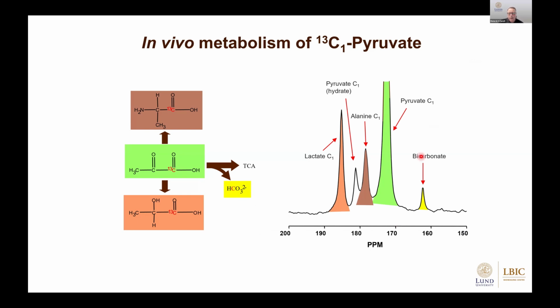We inject the green contrast agent, and during the time, signals for these other metabolites can or might be formed. And that's also the difference between PET and carbon-13. Because for PET, we will not be able to discriminate these three. We'll just look at a total signal. MR has the advantage that it can tell us what the total signal is, and also which metabolic pathways it has taken. But still, as you would say, there is a sensitivity difference.